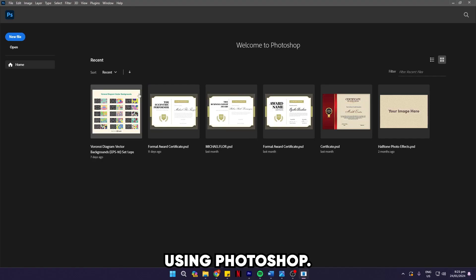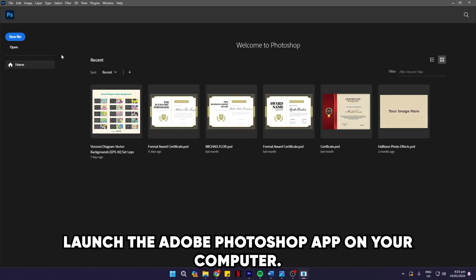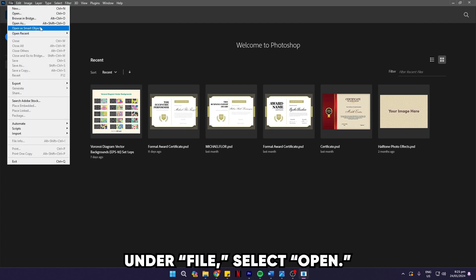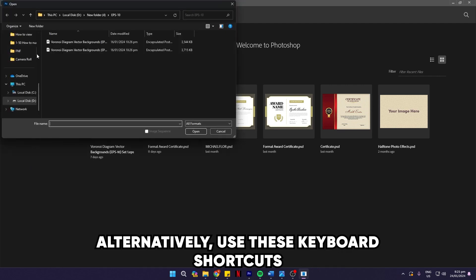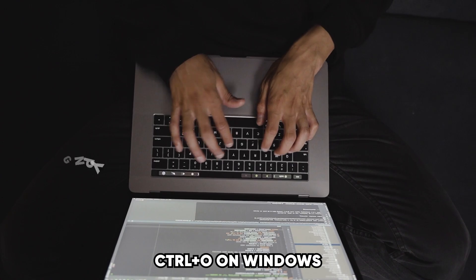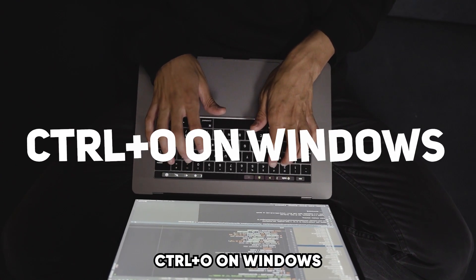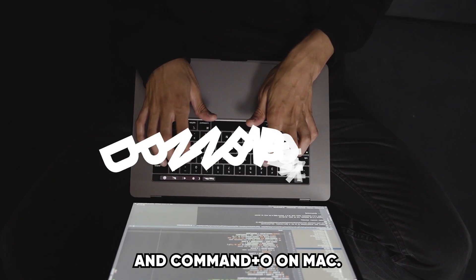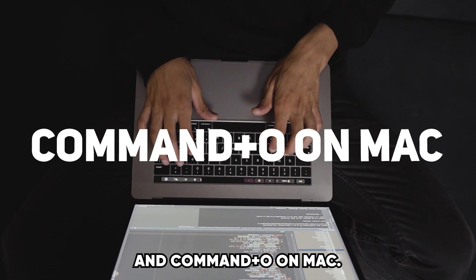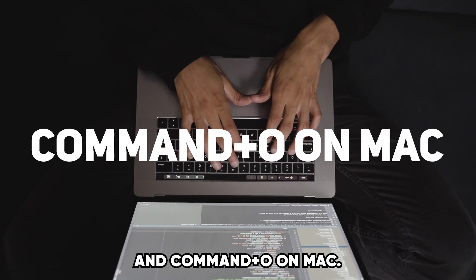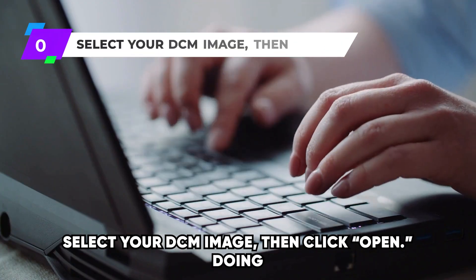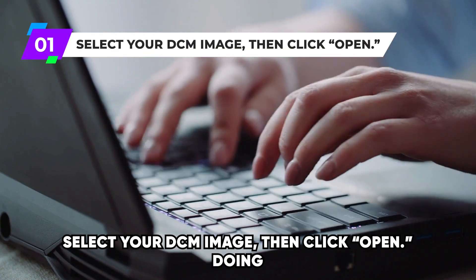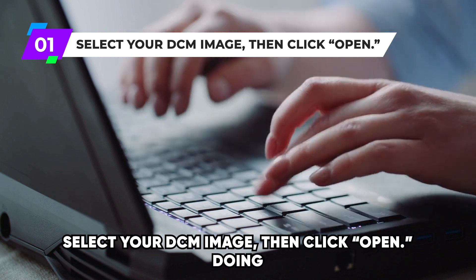Using Photoshop: Launch the Adobe Photoshop app on your computer. Under File, select Open. Alternatively, use these keyboard shortcuts: Ctrl and O on Windows and Command and O on Mac. Select your DCM image, then click Open.